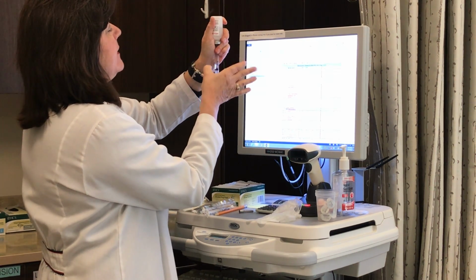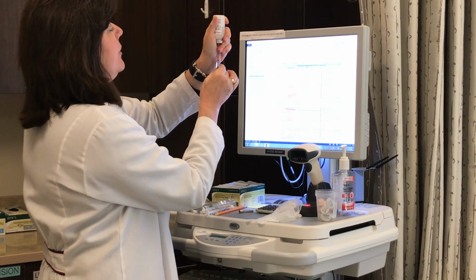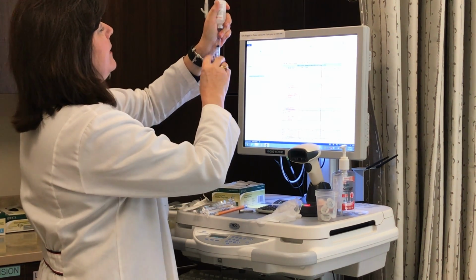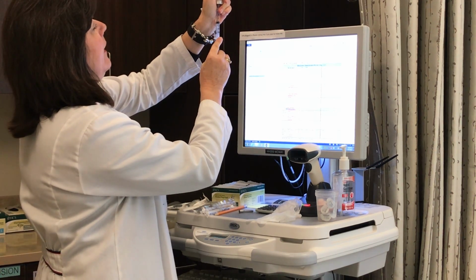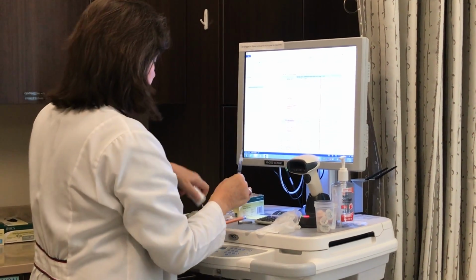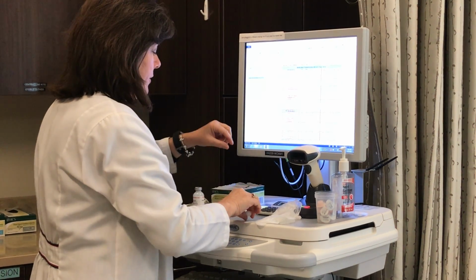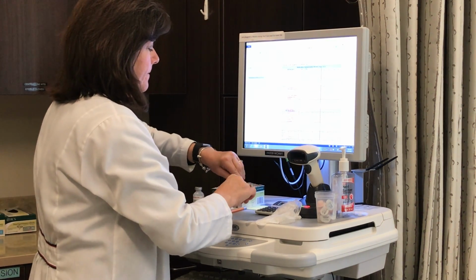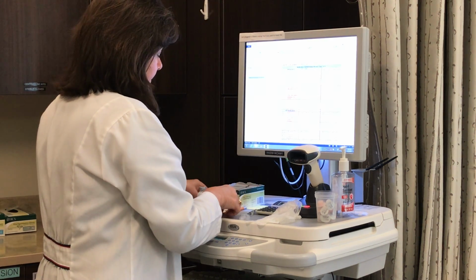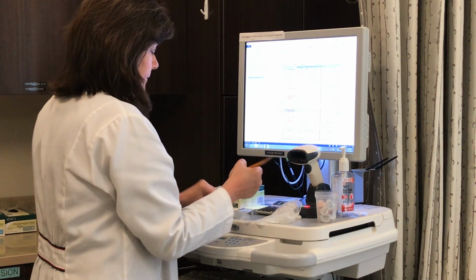Get the air to the top of the syringe and inject it out so that I'm right on the 1.6 mL line with no air bubbles. Scoop to recap. Label medication syringe with name, med, concentration of vial, and syringe.